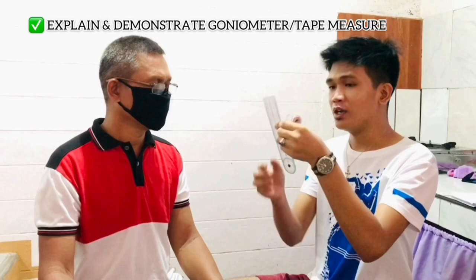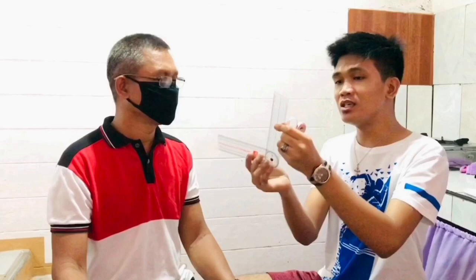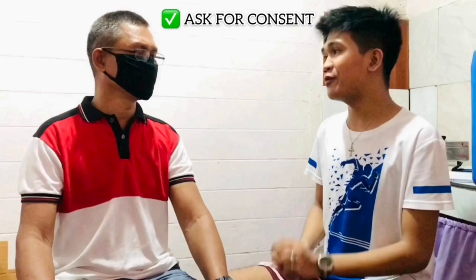To do that, we will be using a tape measure and a goniometer. This one is similar to a protractor; however, it has two arms. This one is our stationary arm and this one is our movable arm. In our case today, I'm going to place this on the outside of your body next to your back. For an accurate measurement, I may have to locate some anatomical landmarks, press my fingers firmly on your skin, and also ask you to remove your shirt. Is that okay, sir?